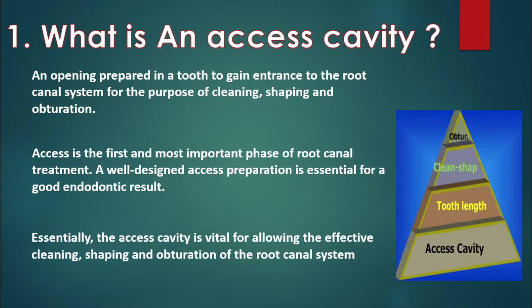So let's define the access cavity. Access cavity is an opening prepared in a tooth to gain entrance to the root canal system for the purpose of cleaning, shaping, and obturation. Access cavity is the first and the most important phase of non-surgical root canal treatment.